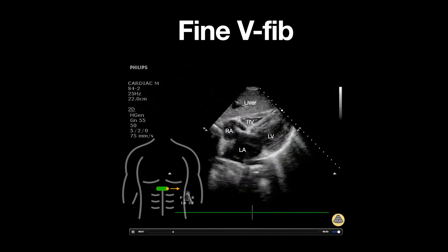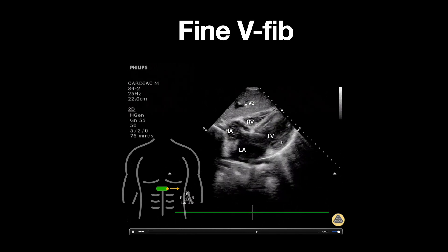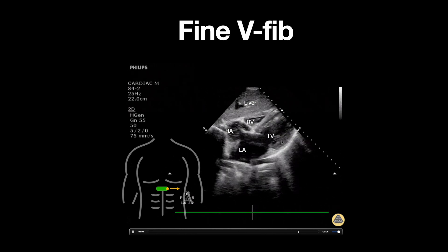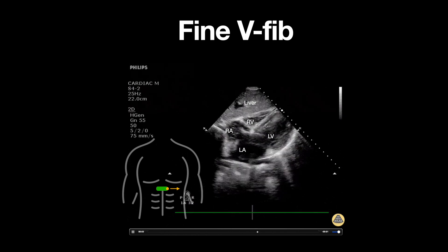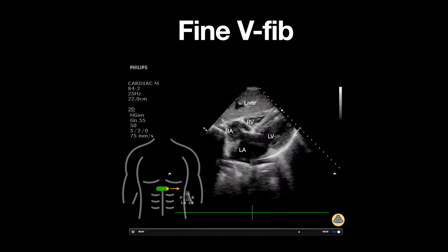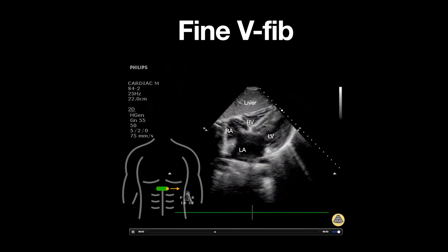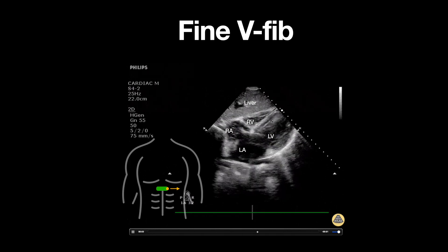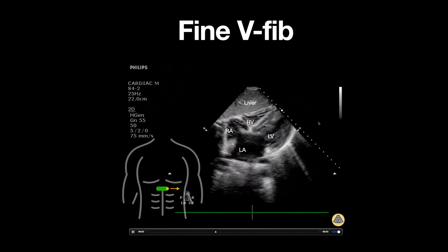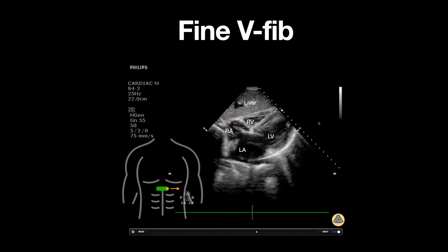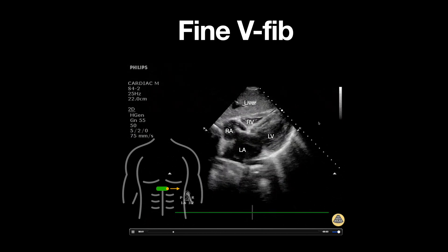Notice that looking at the activity of the heart, there does not appear to be any organized cardiac activity. However, on closer inspection we do see quivering of both the mitral valve as well as the myocardium. This is consistent with fine ventricular fibrillation and needs immediate defibrillation.